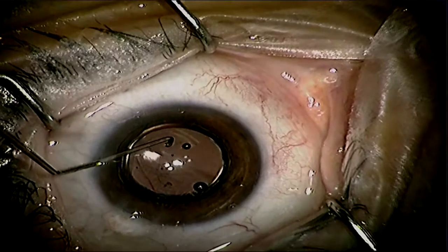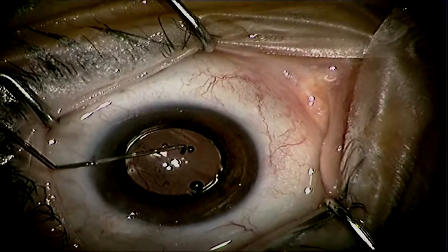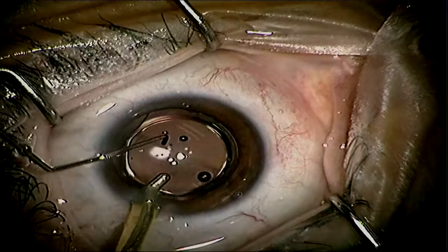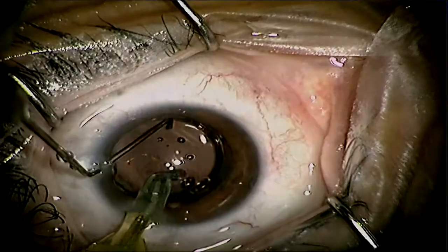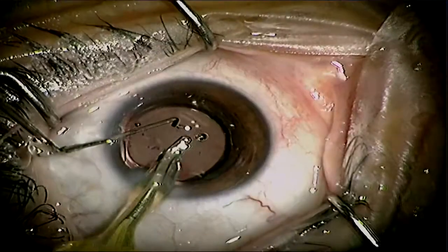That way you don't leave the trailing haptics out of the bag, making it more difficult to get the entire lens into the bag — especially if you have, number one, a small capsular rhexis, or number two, a capsular bag and zonules that are loose and apt to break.